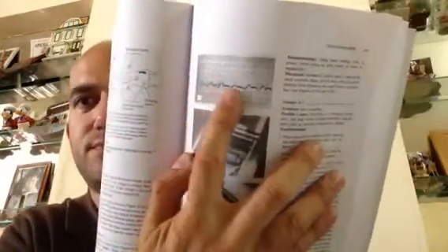Another problem that the machine may face is a smeared trace, which would look like figure 8.26A. The smeared trace would look like this. Possible causes: worn stylus or incorrectly loaded paper. The troubleshooting for this would be to check paper loading and, if proper, check the stylus for wear, pitting, or other irregularities.